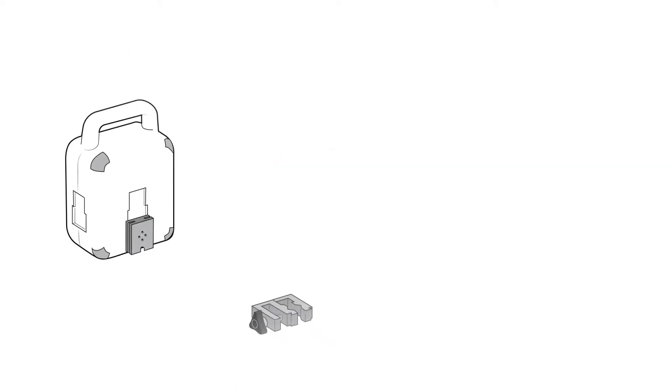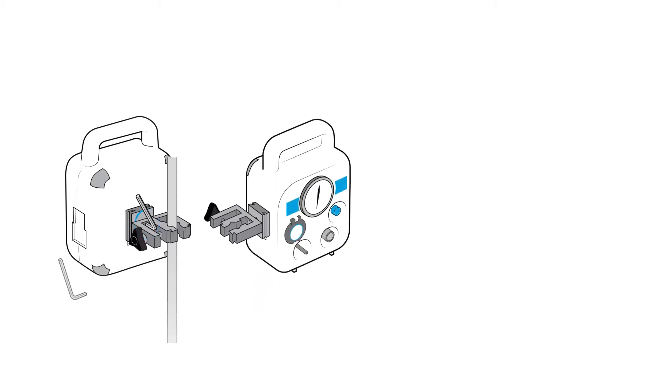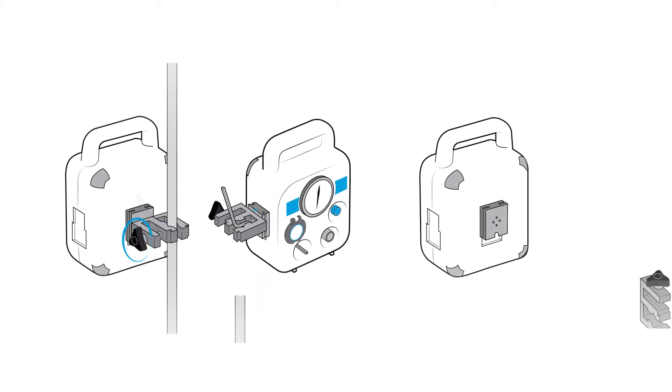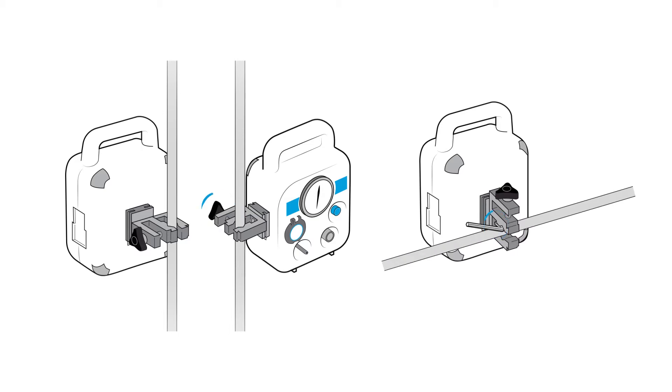Installation. FlexiCare's Neopip Infant Resuscitator can be mounted horizontally or vertically using the universal mounting bracket.